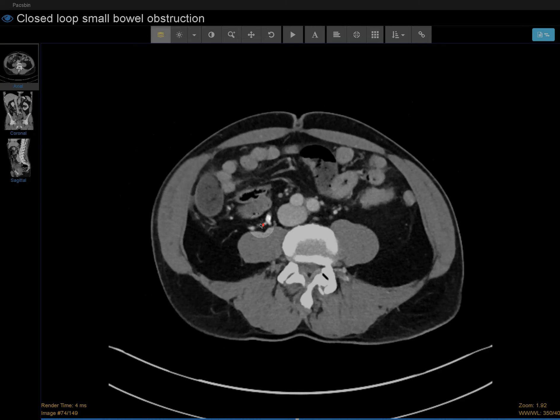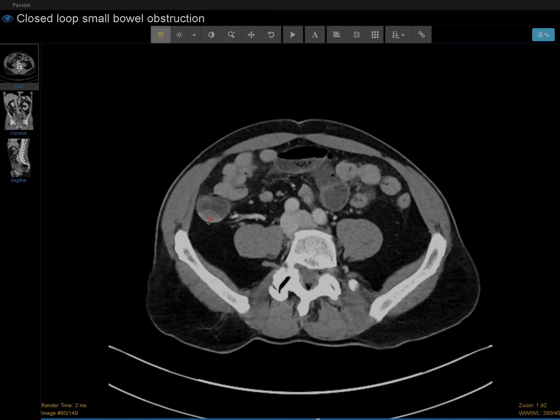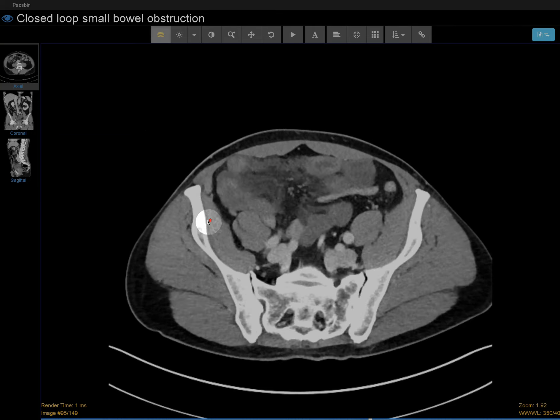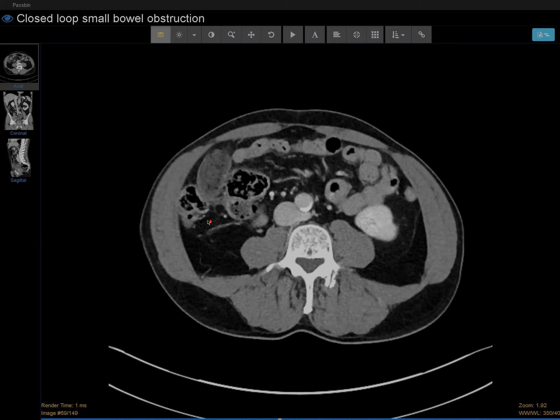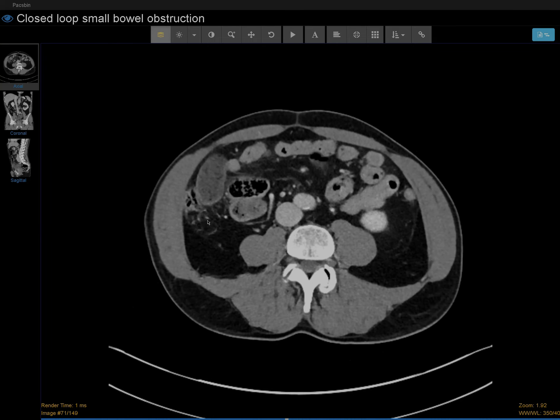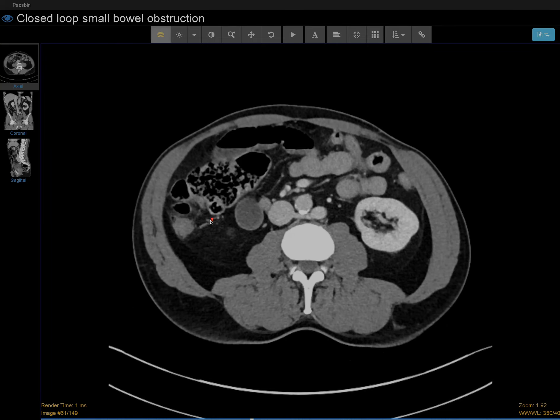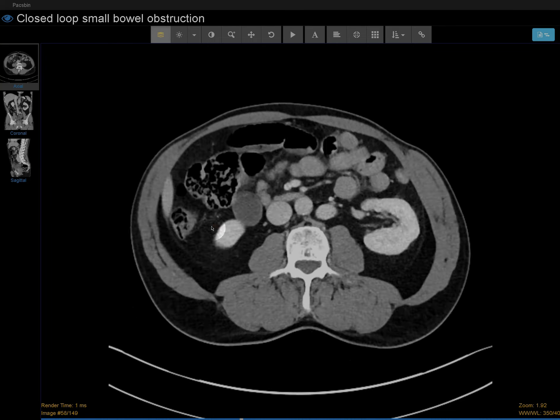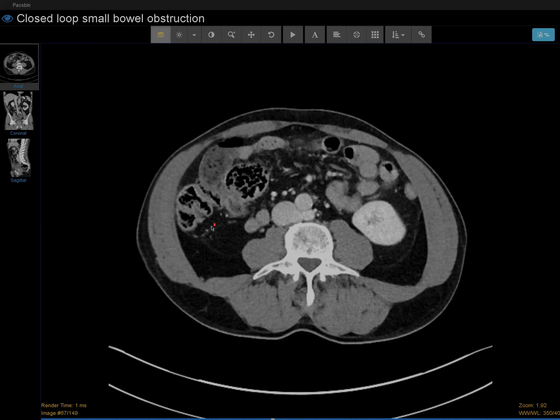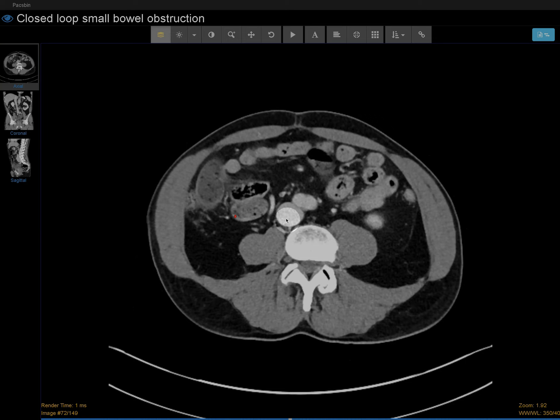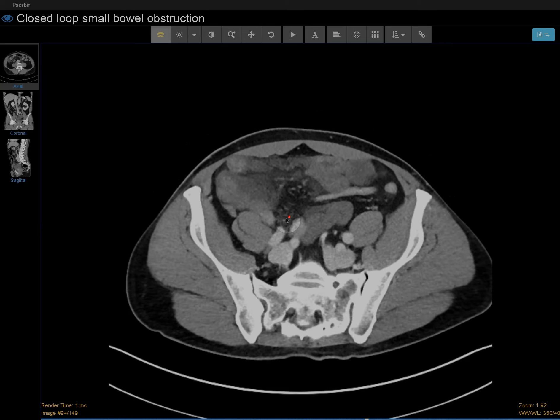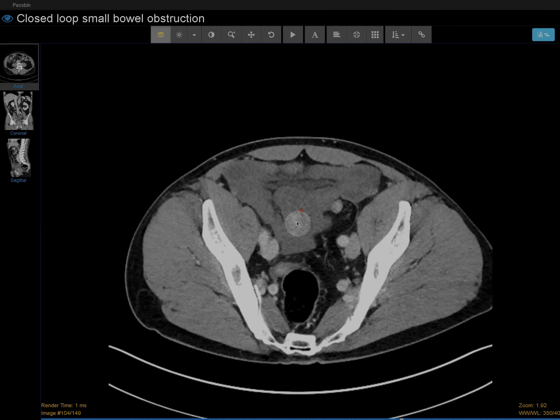Just keep going down on the right lower quadrant around the area of the appendix. I didn't see the appendix right now, but I didn't see much. But as I keep going down more, these loops of bowel look abnormal.